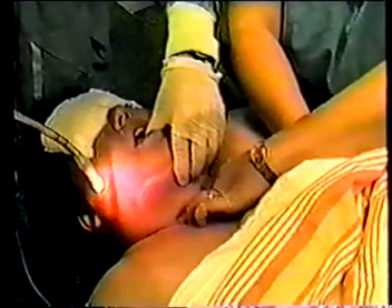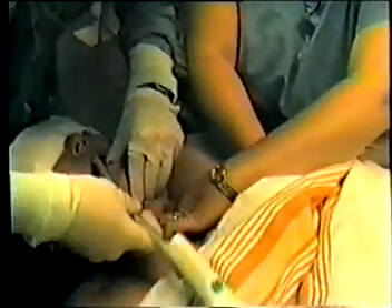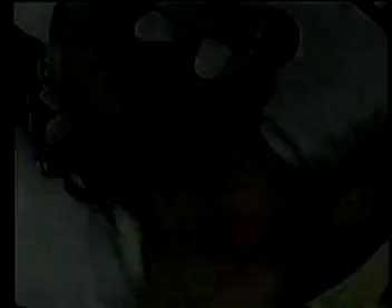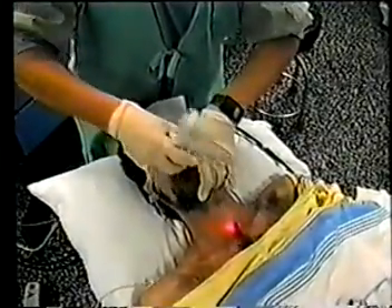While light-guided intubation can greatly simplify the proper placement of an endotracheal tube, all normal precautions should be observed. This is especially true in the morbidly obese patient, where the ability to see the glow may be compromised. In these patients, stretching the skin over the laryngeal prominence can be helpful, and reducing the level of ambient lighting may also help. At the other extreme, in the very thin or frail patient, the glow may not completely disappear even when the tube is in the esophagus. Notice, however, the difference in the transilluminated glow when the TrachLite and tube have advanced beyond the cords into the trachea.